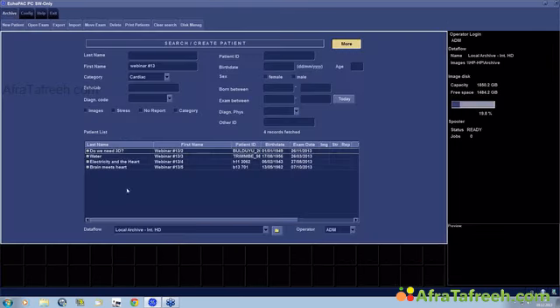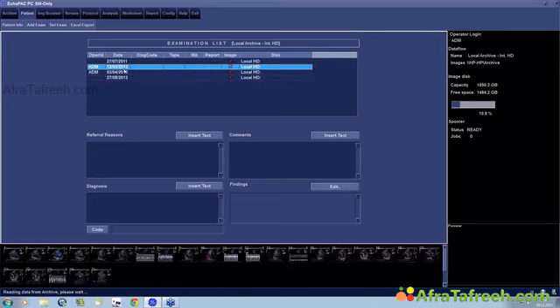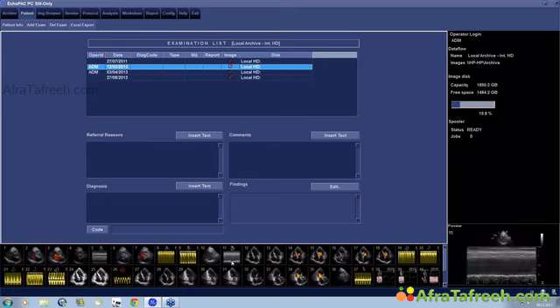Okay, let me switch to the next patient. Okay. Okay, let's start with this echo here.